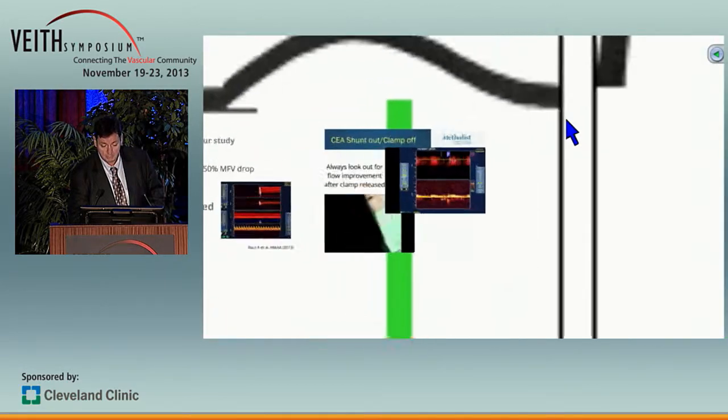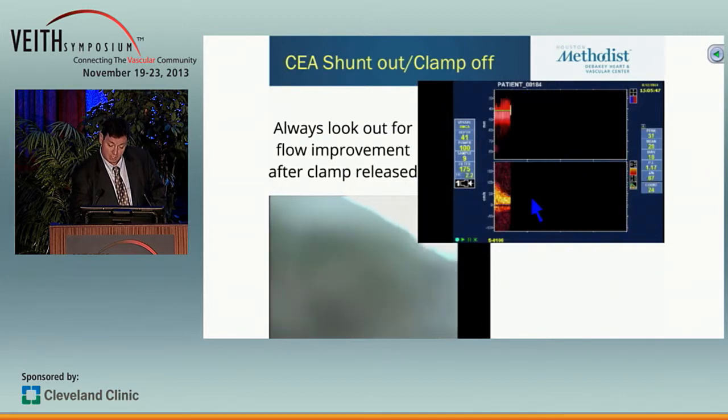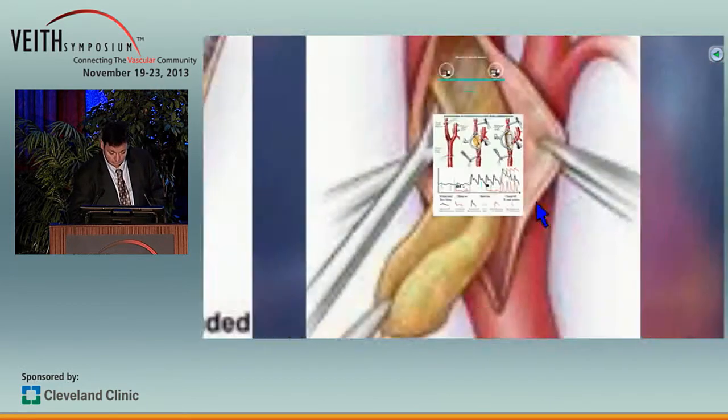The most important part at the end of the surgery is that you would like to see improvement of the flow. This is when you are comfortable leaving the operating room. If you do not see that improvement of the flow, out of the 100 cases we just reviewed, we had 3 reoperations where we had to reestablish flow and see flow improvement before we closed the skin.